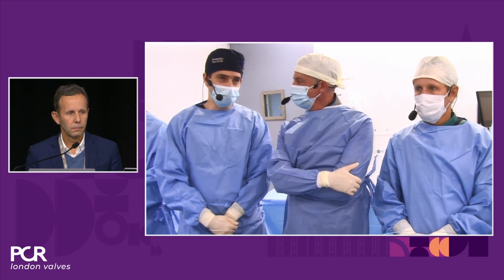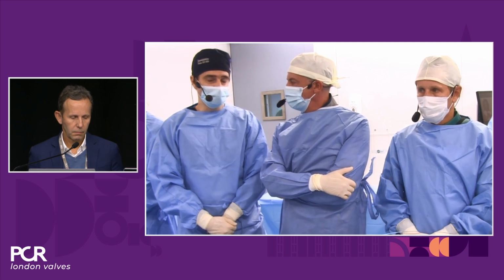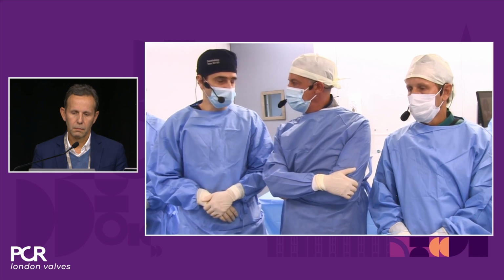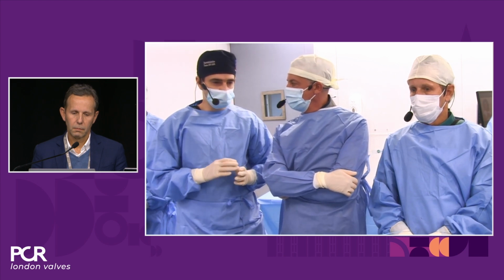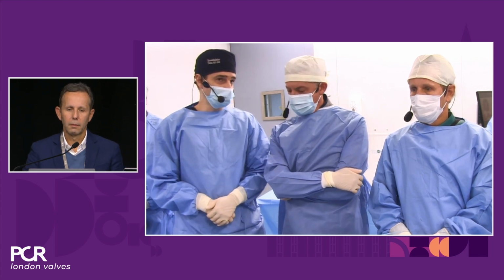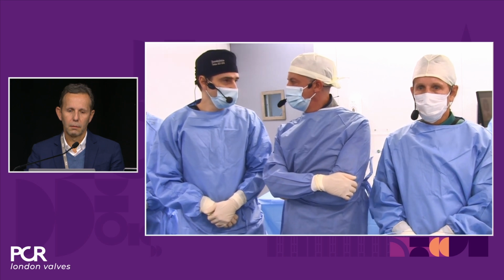That's a very good question, Alex. In fact, if you look deeply at the data, there's some data showing that in patients with a prior bioprosthetic valve failure, and in bicuspid valves, certainly more debris was captured. However, recent analysis did not show that in such patients the reduction in stroke rates was lower. So honestly, we are not quite sure if we should use it in all patients, or select patients in certain circumstances. For sure, this patient has more than 3,000 Agatston units in the calcium score, very severe aortic stenosis. So it's a situation where, honestly, if this device were available, I would definitely use it.